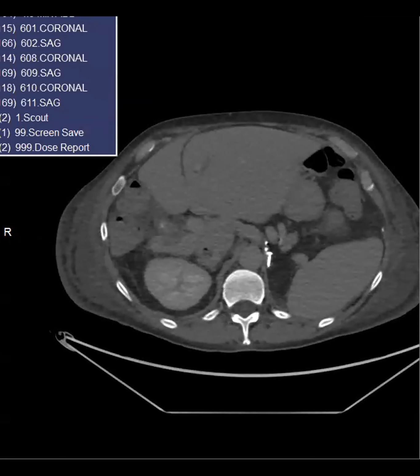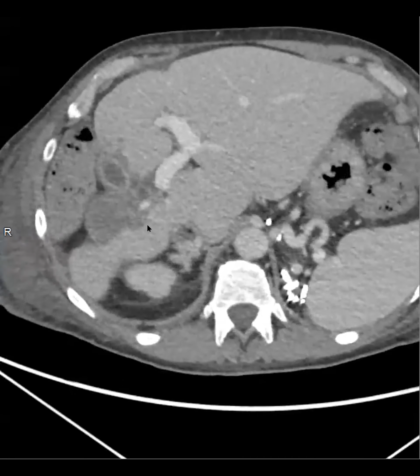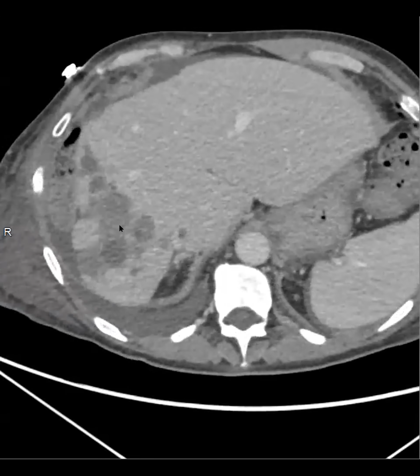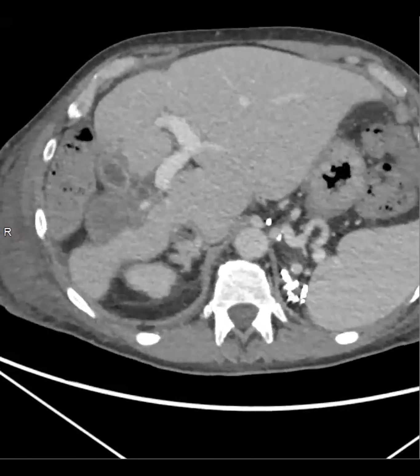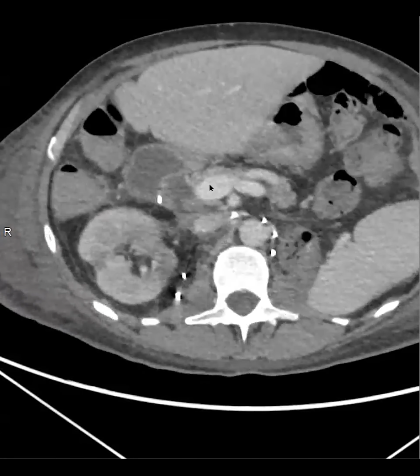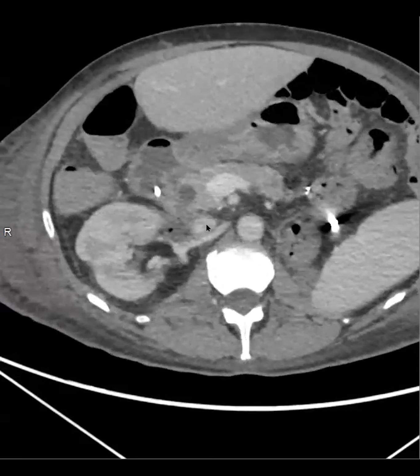That's awesome. Victoria, what is that stuff going on in the liver? That's unrelated. Oh, these are mets. Okay. So he had mets. Some of these are mets. These are fiducial markers. So he's not a healthy man. He had PE. I don't like the indication for this CT. It literally said that they're concerned with duodenal perforation, but why? Like, what made them think of that? I don't know. It looks like there's a clip in the duodenum there. Like maybe they did an EGD and they clipped off an ulcer or something.